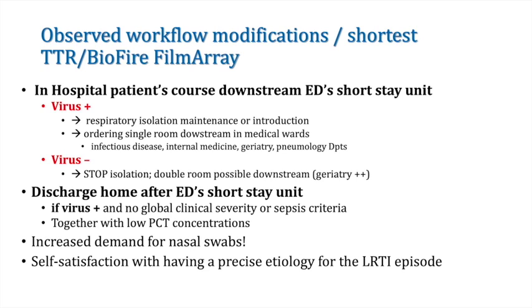The second workflow modification was the possibility to discharge patients home after the ED short stay unit in case of a virus identification, if the patient, of course, had no global clinical severity or sepsis criteria. We coupled this decision between virus-positive isolation and low PCT concentration. The third observed modification in the workflow was an increased demand for nasal swabs during this period.